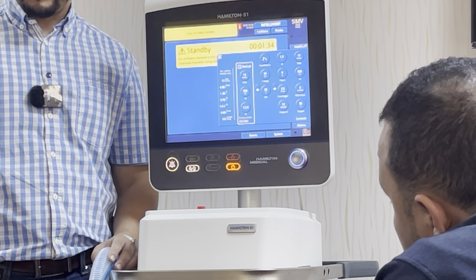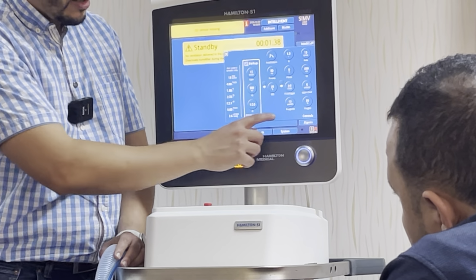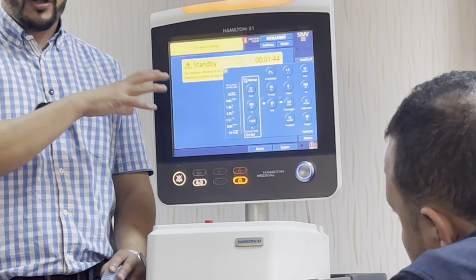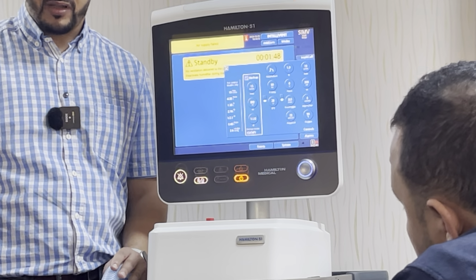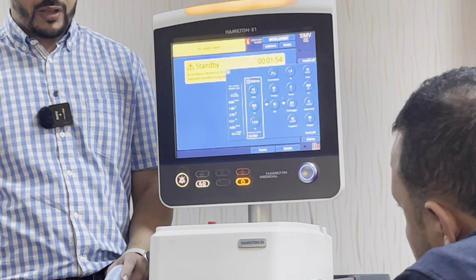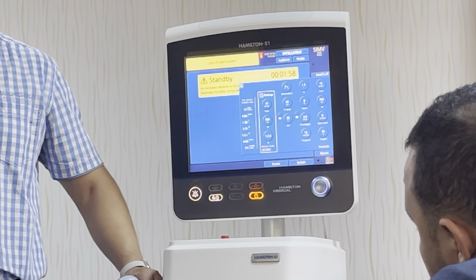But if the patient has triggered the machine during the first half, it will take 15 centimeter water of pressure support as if he is in a CPAP mode. So the SIMV mode will work as a CPAP mode if the patient is spontaneous with the pressure support, and if the patient is passive without spontaneous breathing, the machine will deliver the 500 milli like the CMV mode.